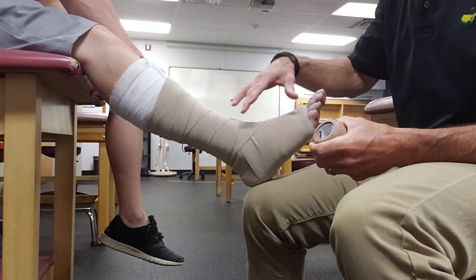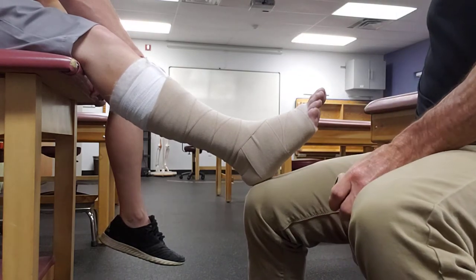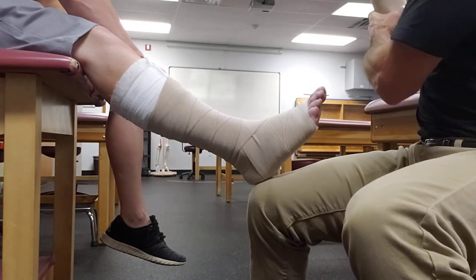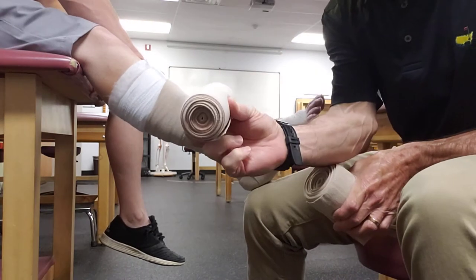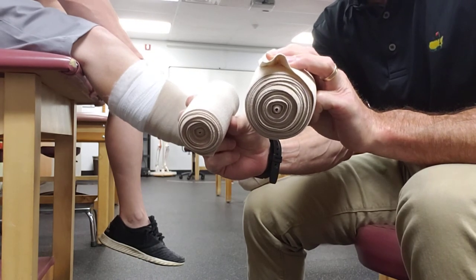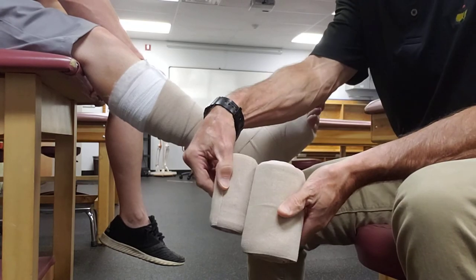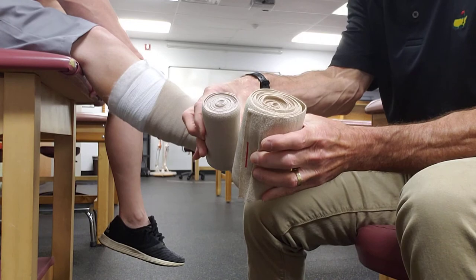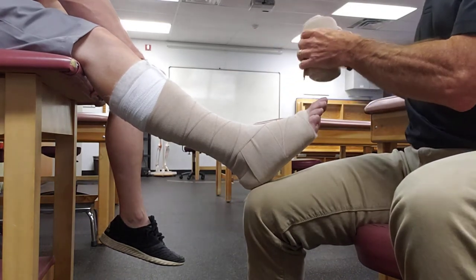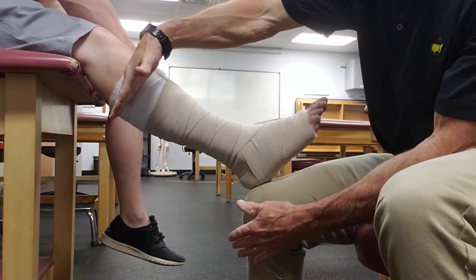I probably could have gone a little bit higher on the leg. For someone without edema, the bandage is this size in diameter, but somebody with a lot of edema will have a really large leg, so you'll need the bigger size, which has a lot more length — probably twice as long. Ideally, I would have applied this one so it came up just a little bit higher on his leg.